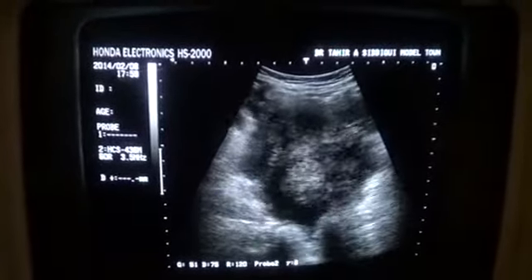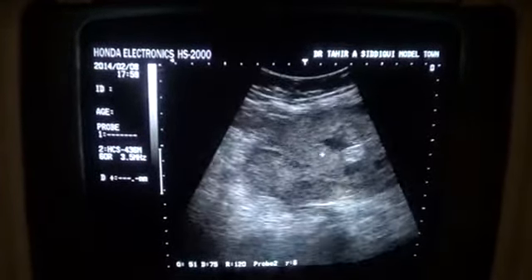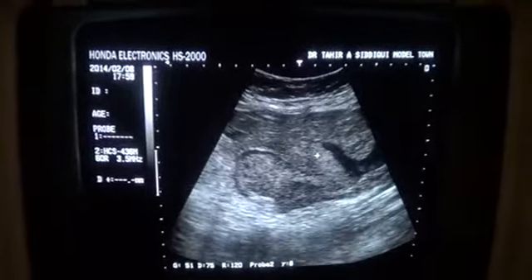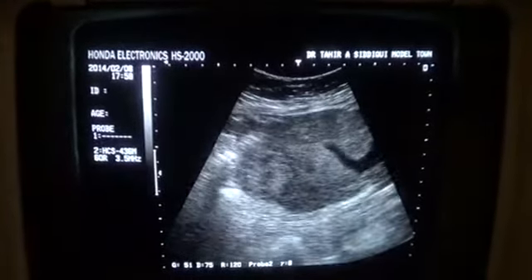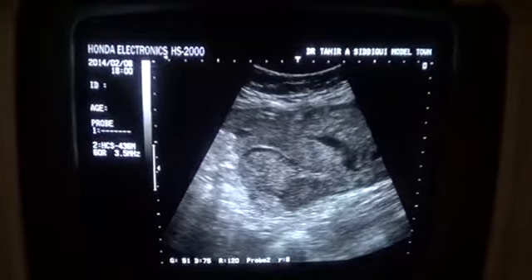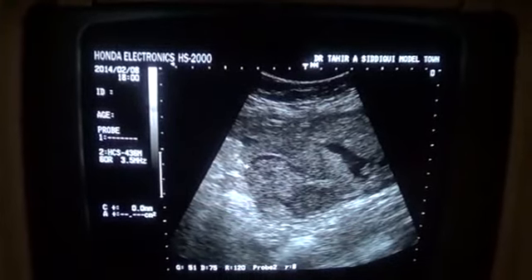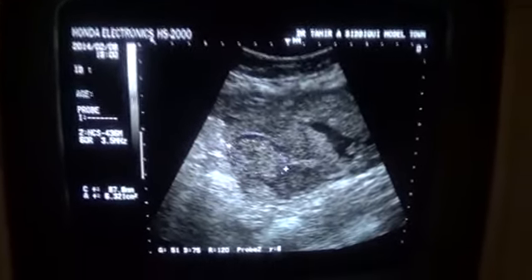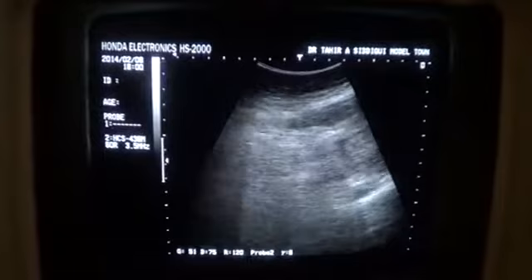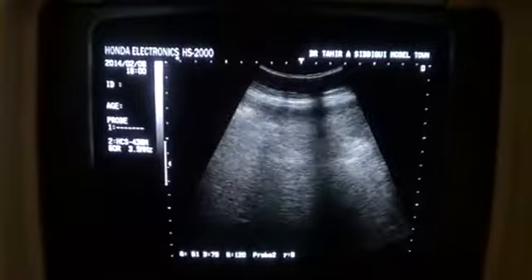So this finding, when I go to the left side, persists. So it expands on both sides. Now this is the ovary. This is the ovary which is entrapped by the echogenic area, extending from the pelvic cavity in the midline up to the umbilical region.